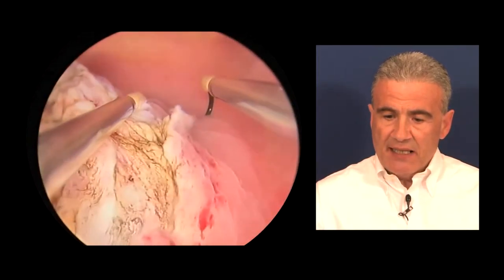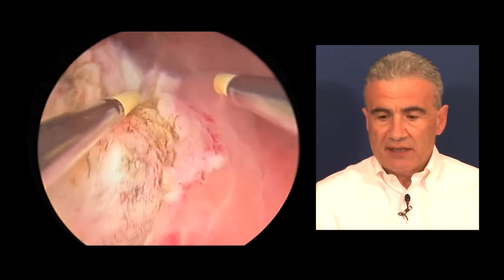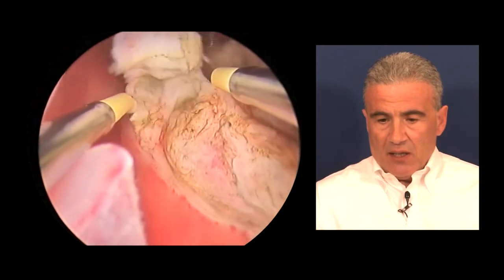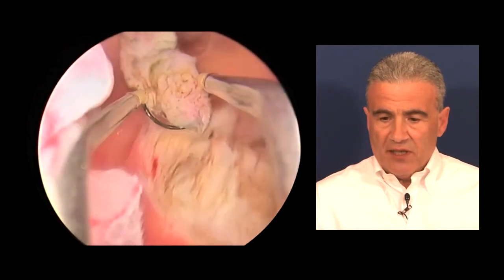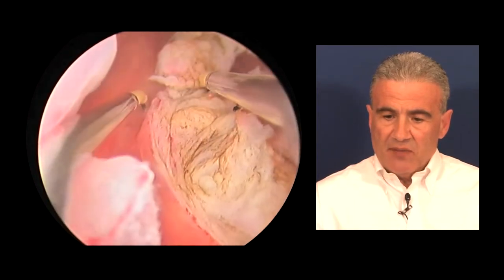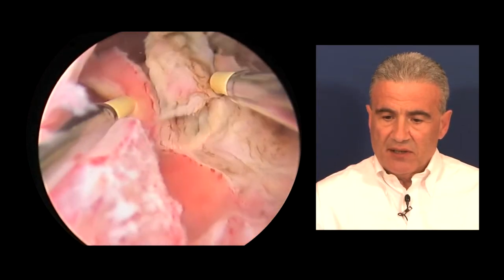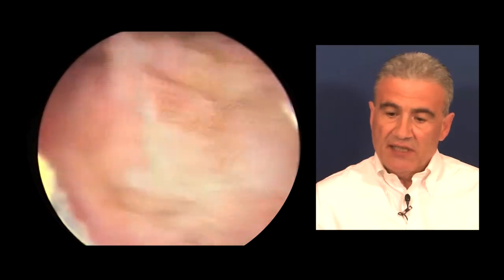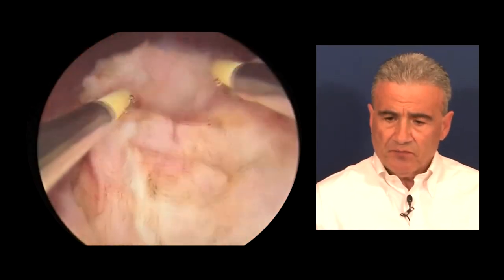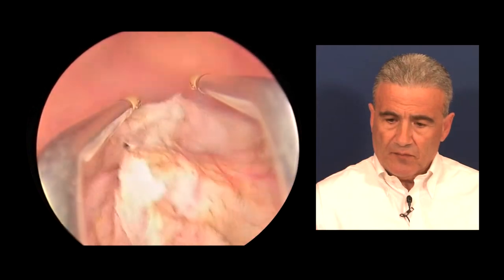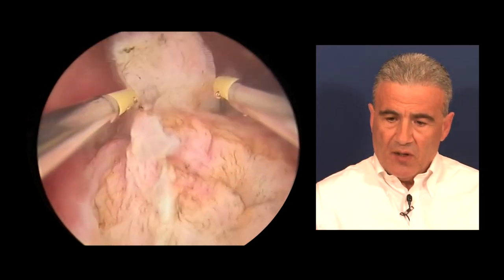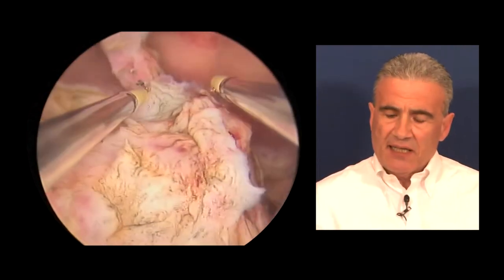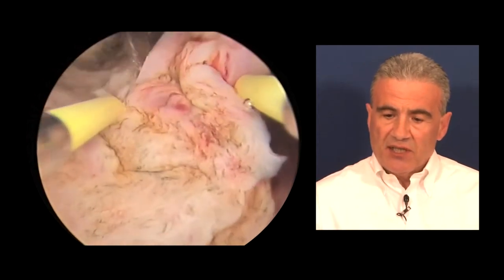We see that the intramural cleavage plane of the myoma is beginning to take shape. Here we see another completion of the extraction of the neoformation fragments at intracavitary level. Here is an additional identification of the cleavage plane. At this point, the surface of the myoma must be levelled with the surface of the uterine wall.